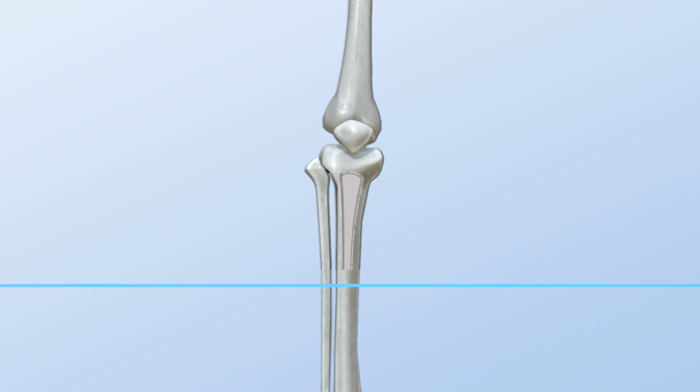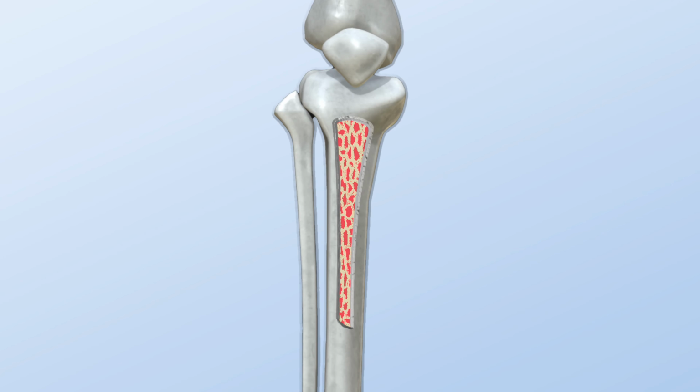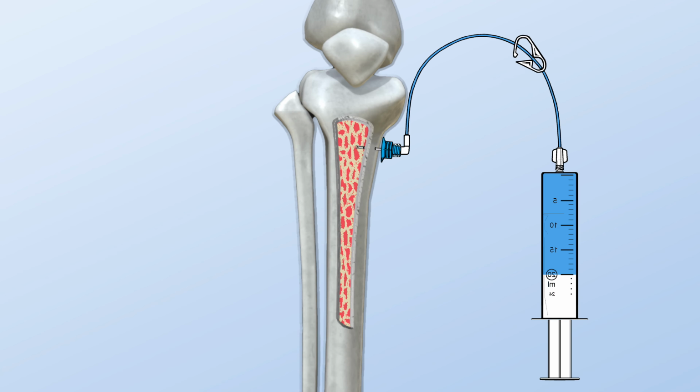Bone marrow aspiration is performed, followed by a thorough flush of at least 10 milliliters. For kids, use 2 to 5 milliliters to break through the bone trabeculae and allow the passage of administered medicinal products. The actual insertion of the needle into the bone is not significantly painful. However, the subsequent flushing is significantly painful.